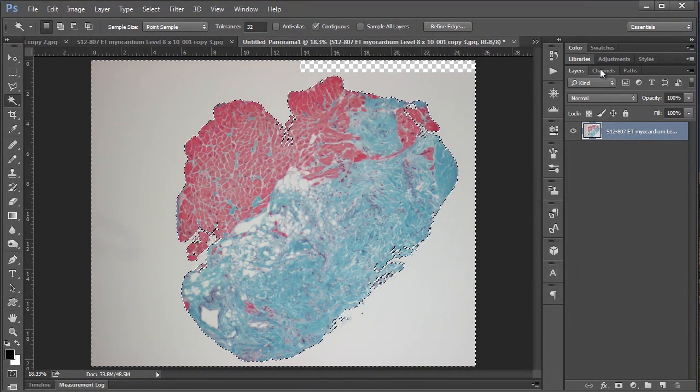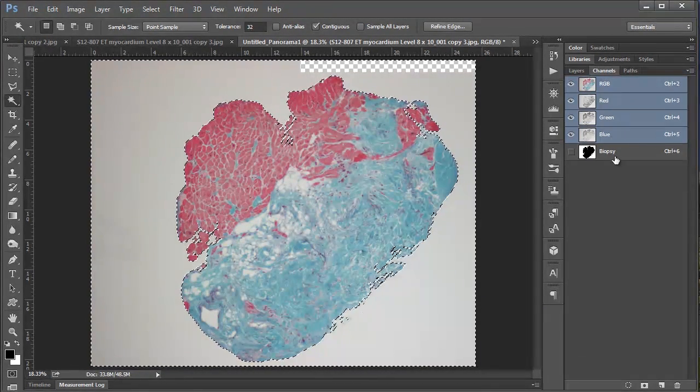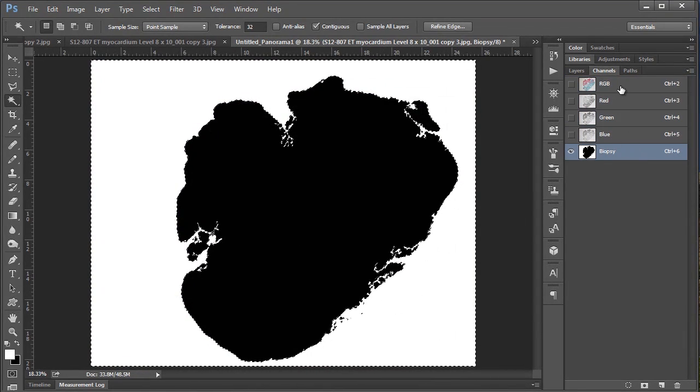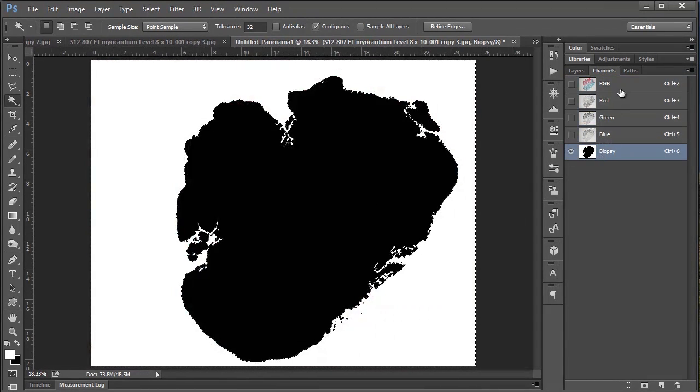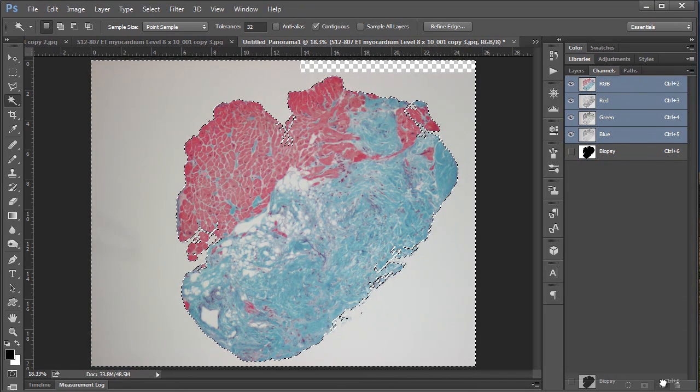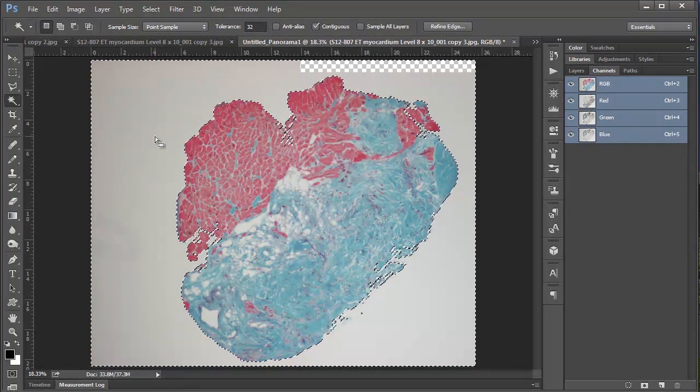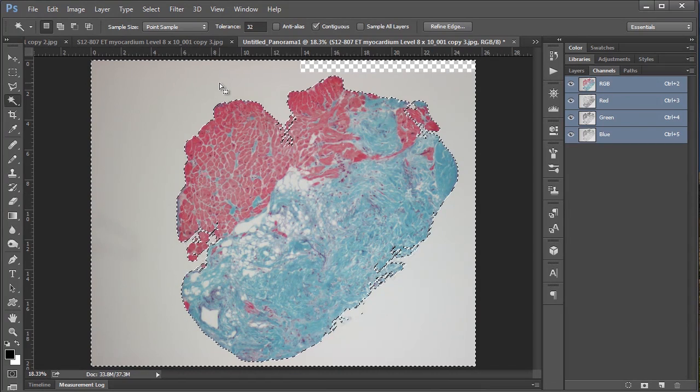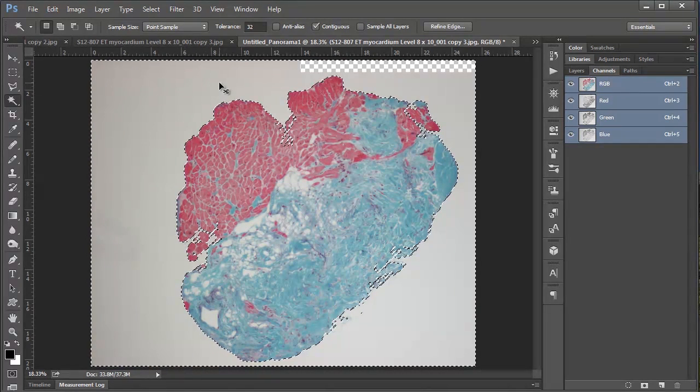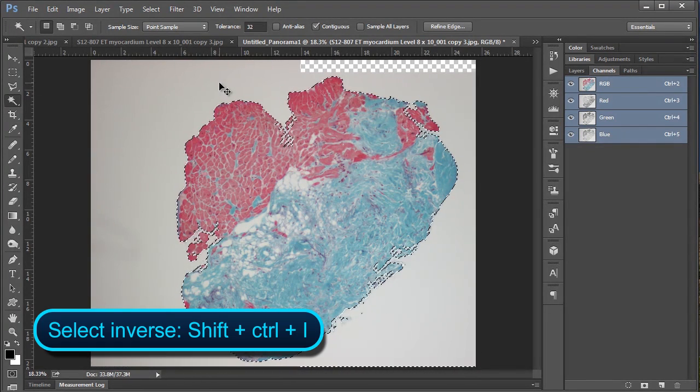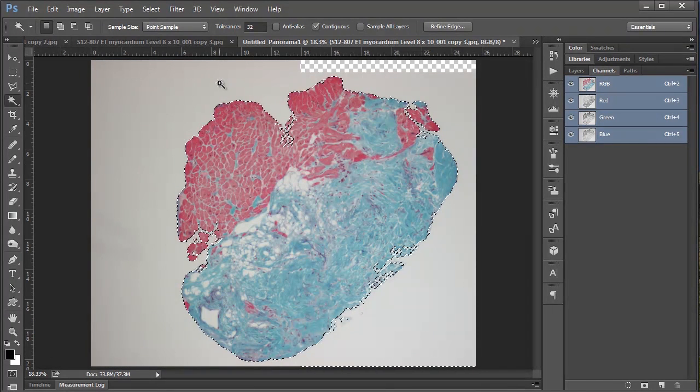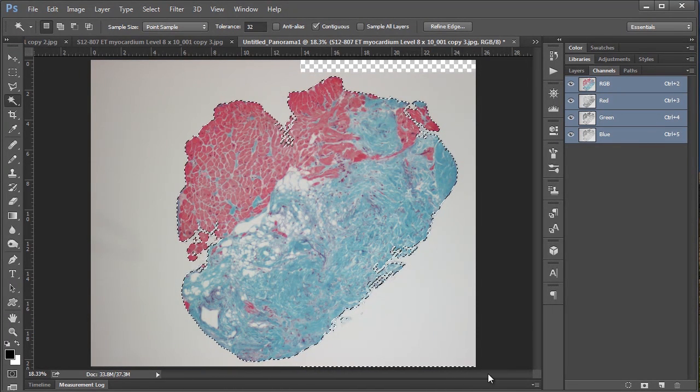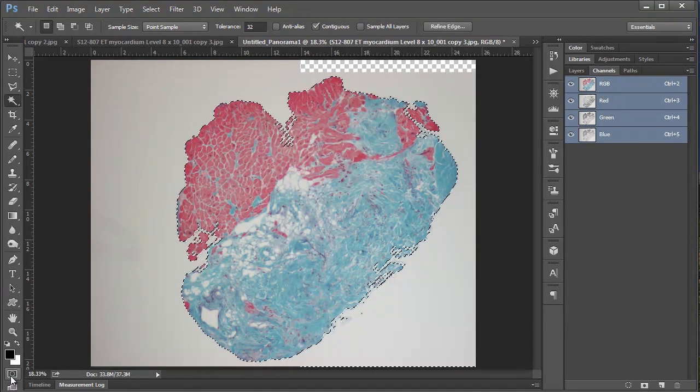And so what that does is if you go to your channels panel. Actually you know what, okay I made a bit of a mistake here. So I'm going to throw this away. And I should note I've selected in this case everything but the heart. So before I save my selection what I want to do is inverse it. So I'm going to hit control shift I. And that's going to give me the inverse of my selection. And I see that I have some more selection down there.